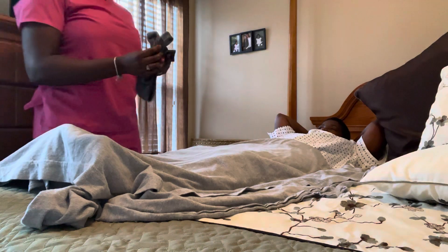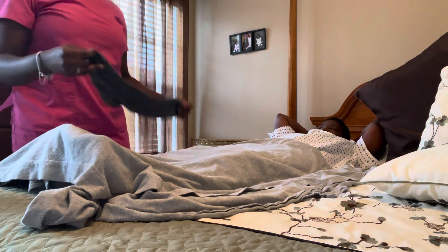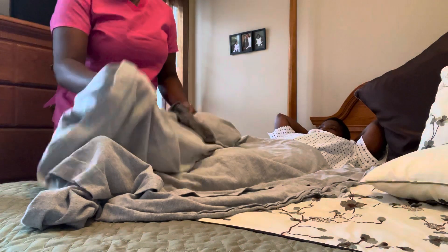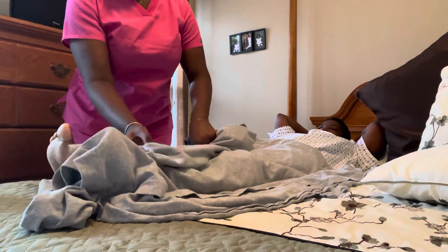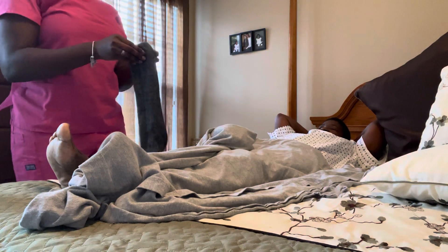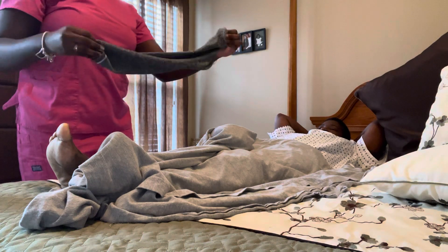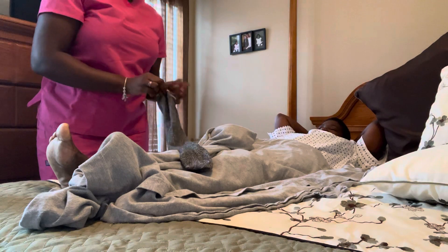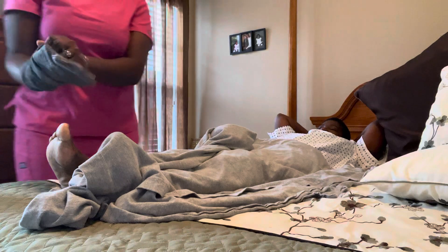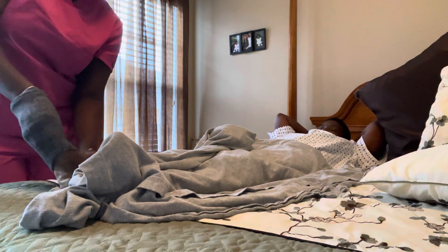So I'm going to check the stockings, making sure that they are the right size for the patient and making sure that they are clean. I'm going to expose one leg. I'm going to turn the stocking inside out.